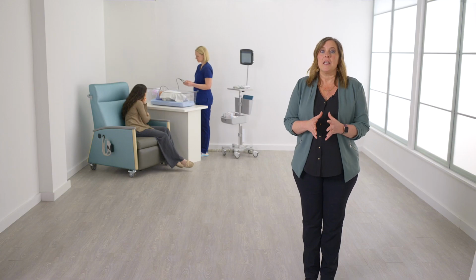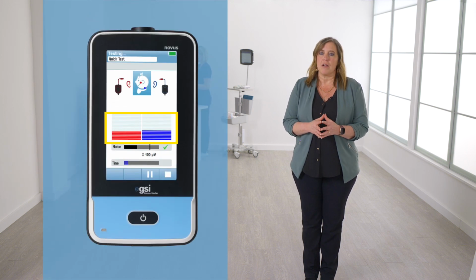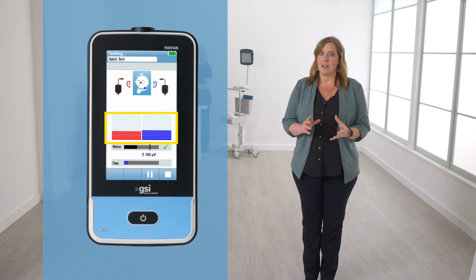The testing screen displays 3 key pieces of information to observe. First, the bar graph or graphs in the center of the screen will show the progress of each ear toward a pass result. The red bar indicates the AABR response from the right ear, and the blue bar indicates the AABR response from the left ear.